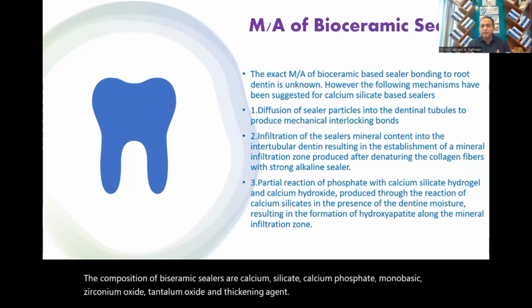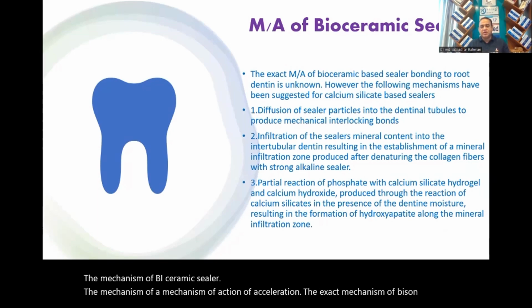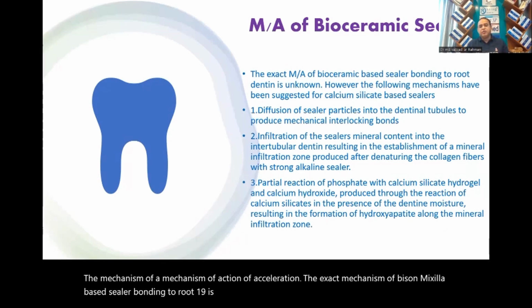The mechanism of bioceramic sealer. The exact mechanism of bioceramic sealer bonding to root dentine is unknown. However, the following mechanisms have been suggested for calcium silicate-based sealers.